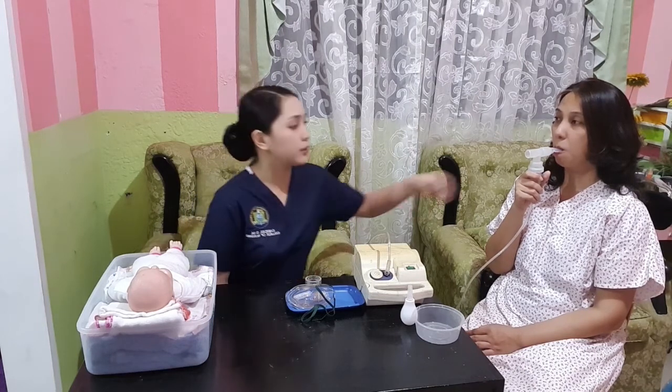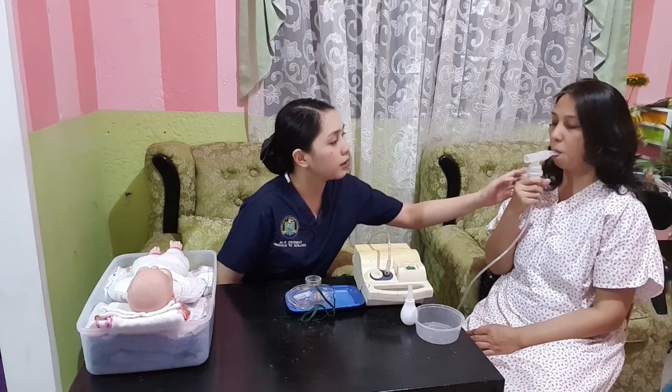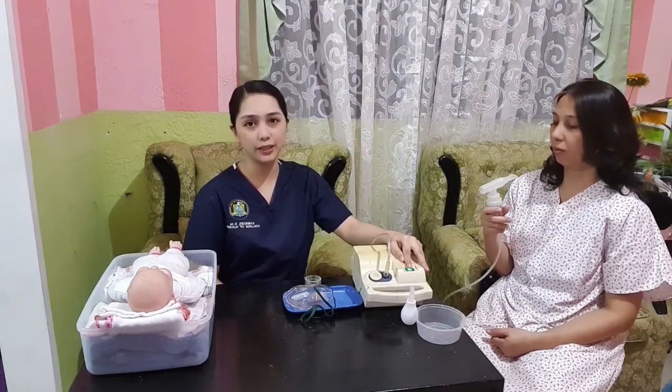Okay. Then tap the nebulizer cup occasionally during treatment and toward the end of the treatment. So I will tap. When medication is completely nebulized, I will now turn off the machine.